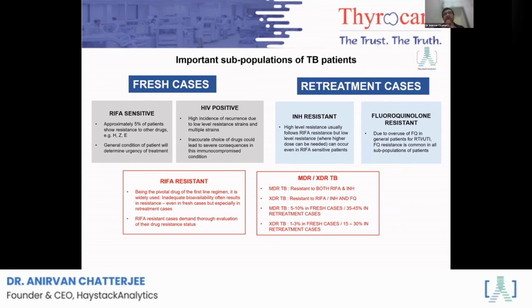But at least every TB patient which is rifampicin resistant on GeneXpert, can't we get them into a whole genome sequencing test? Isn't that worth the gamble that we want to take so that after 12 days, we have the report from 18 antibiotics and the clinician is now empowered to give the patient the right drug at the right time? We think all presumptive MDR cases, all retreatment cases, all relapse cases must undergo whole genome sequencing as a screening test before the doctor takes the plunge in. This is probably our best chance at stopping the rise in XDR and stopping the rise in XXDR.